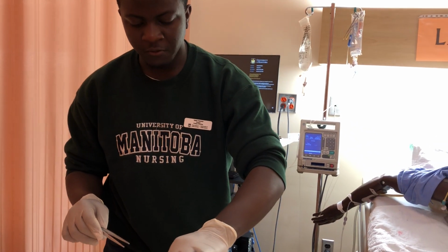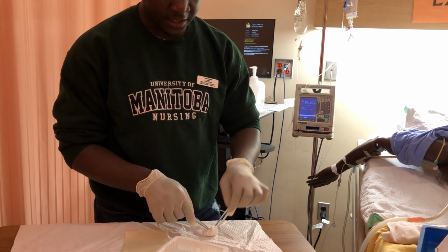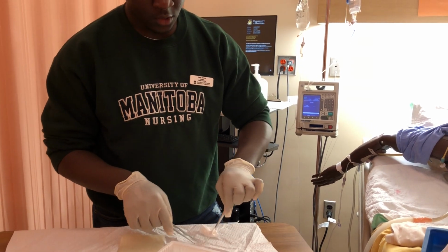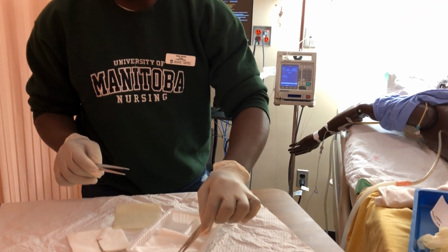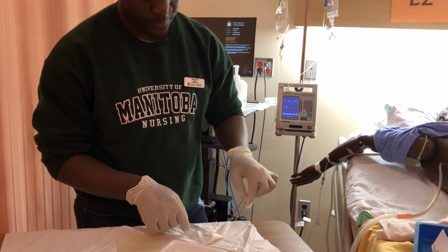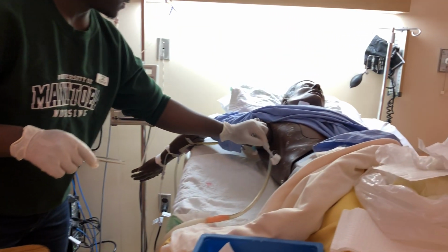And I can just use a 4x4 to dry around my wound, my chest tube site. And now I'm just going to put on my dressing. So I'll just use this dry one, go around it once. Then I'll make sure to use one last one to dry it. I'll just dry that side, and I'm all good.